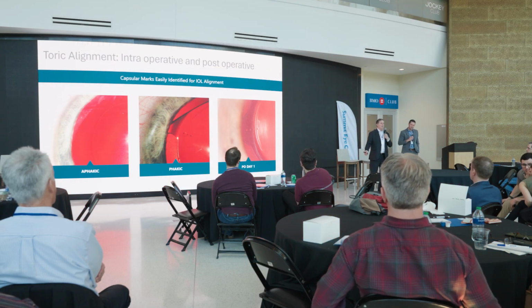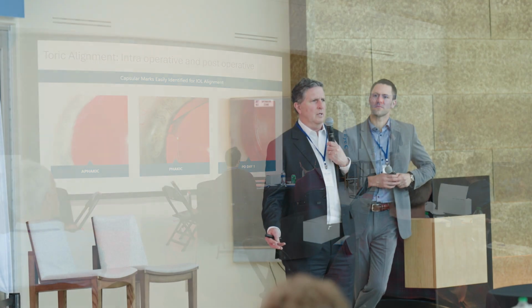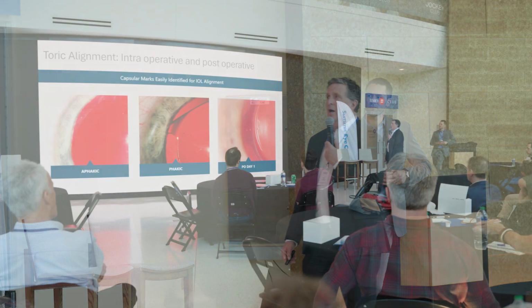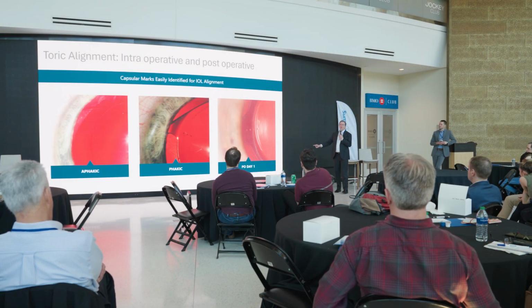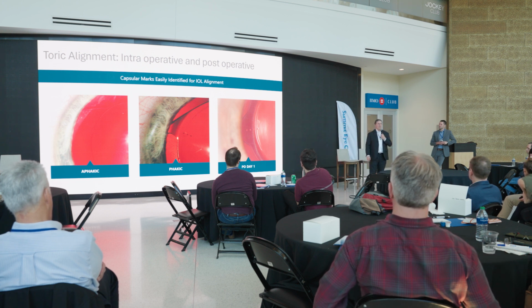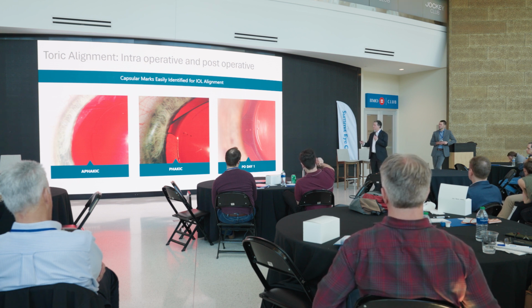Well, then you check and you see where you are. I mean, if they still have a 3/4 diopter, are we going to go back in and adjust that? Maybe. We can do that at the slit lamp. Then you start using common sense, all right? It could be these lenses can rotate slightly, and so again, then you use common sense and say, all right, what do we have? Almost certainly, even with that, they're better than they were before. And so maybe we lost 10% of the toric power, still got 90% correction. And I can tell you that's way better than it would have been without.